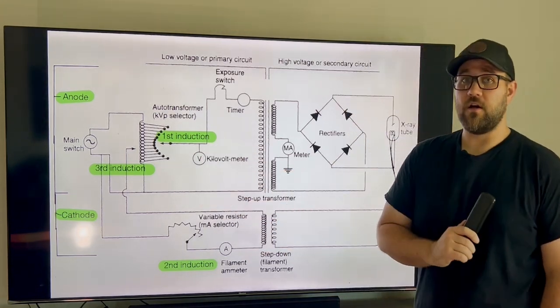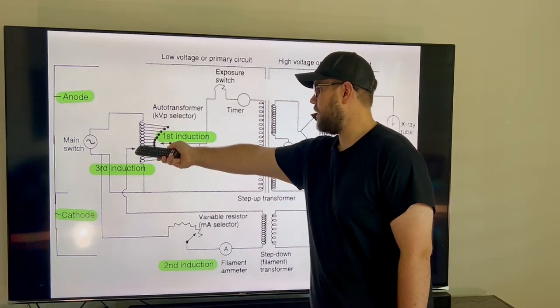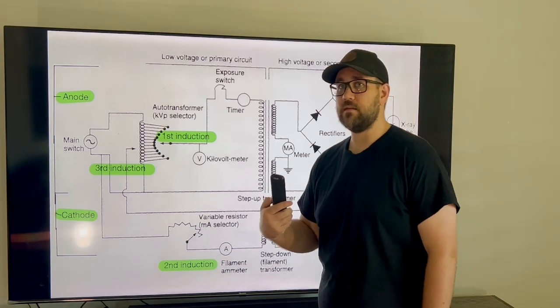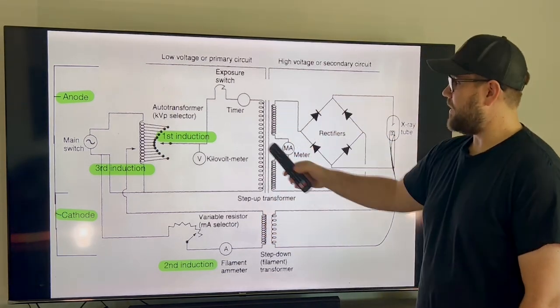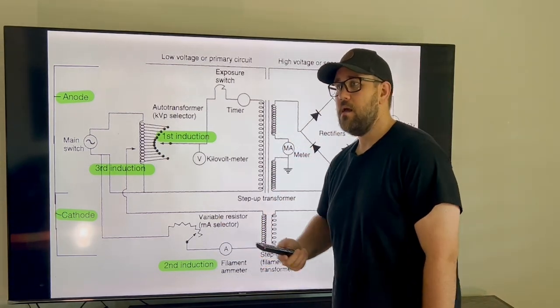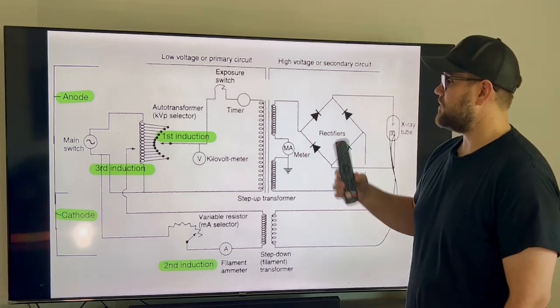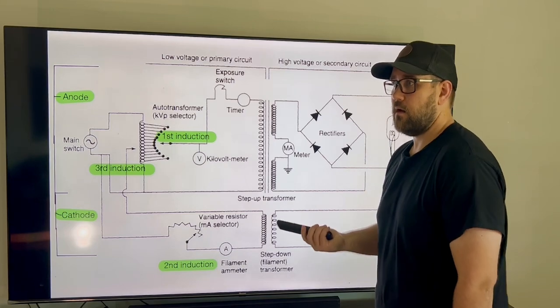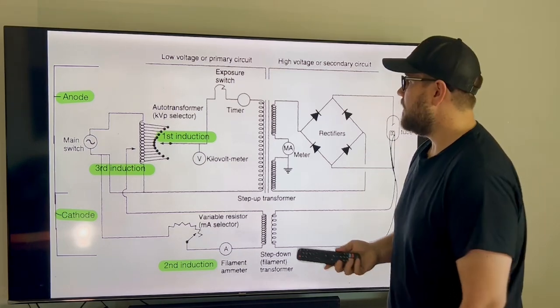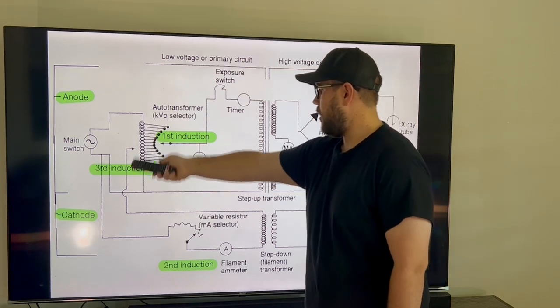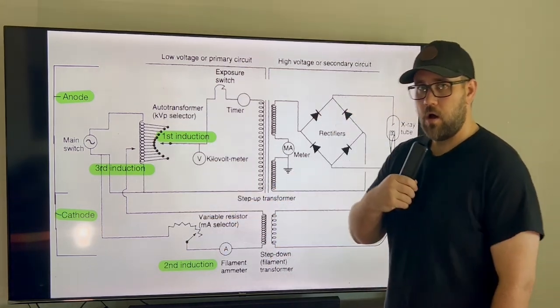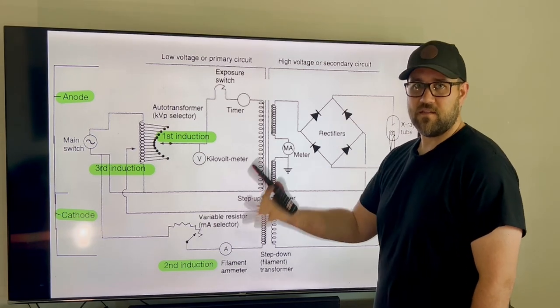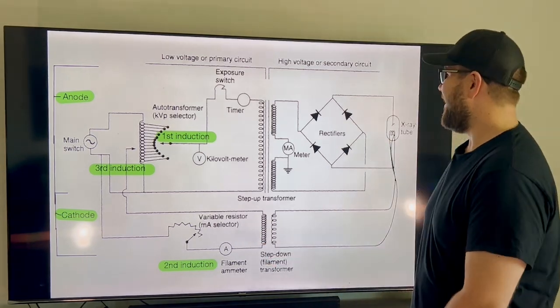We're going to have our third induction right back at the auto transformer with this line being induced back in. Now something I want to preface is I went one step at a time and it was pretty slow, but in this process of starting it up, setting the technique, and having everything run, because it's electrical current, it's going to happen really fast. These three lines that I just talked about here are going to be happening pretty much all at the same time very quickly. So just know that, but in this demonstration, obviously we can't see that.